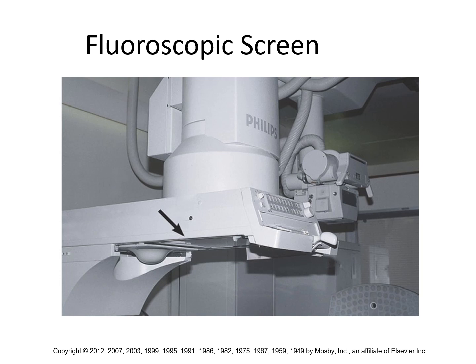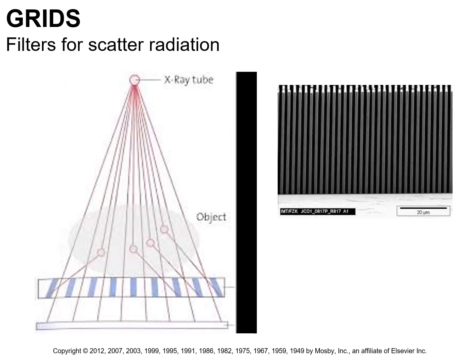It's actually the first iteration of an electronic eye. And it takes the X-ray and turns it into visible light going through the image intensifier. Okay. Now our fluoroscope, our motion picture X-ray fluoroscope, which this is one, has largely been upgraded to the new DR flat panel fluoroscope, which takes the DR plate and replaces the image intensifier with a flat DR panel, okay, like you saw on the previous slide.